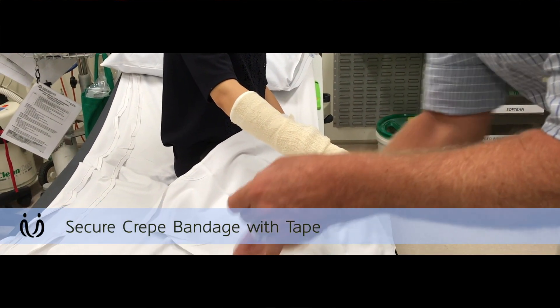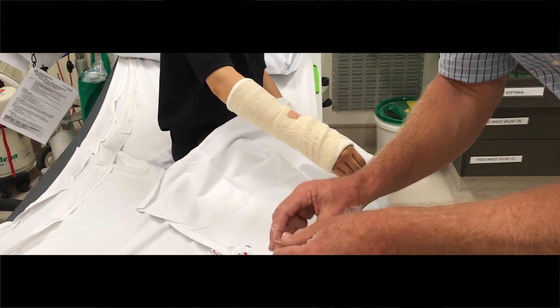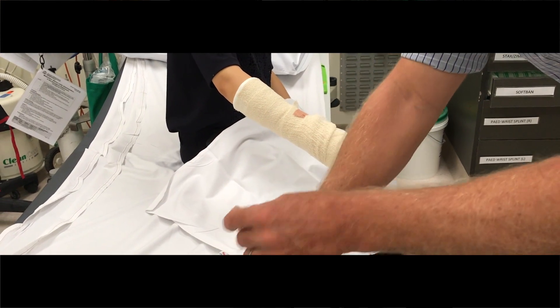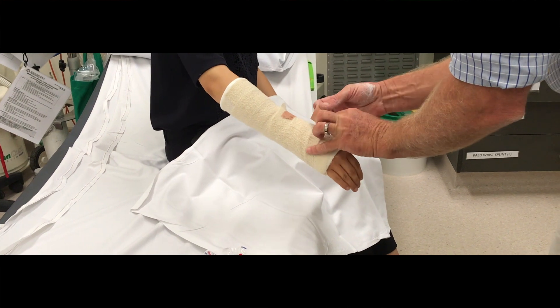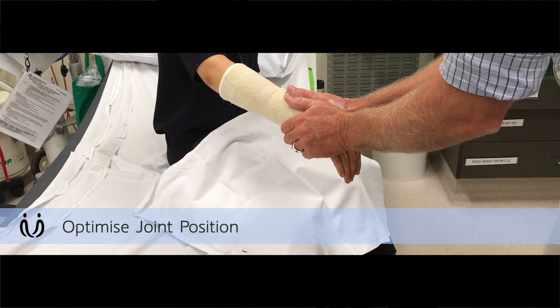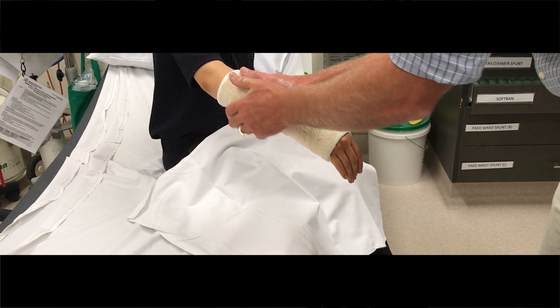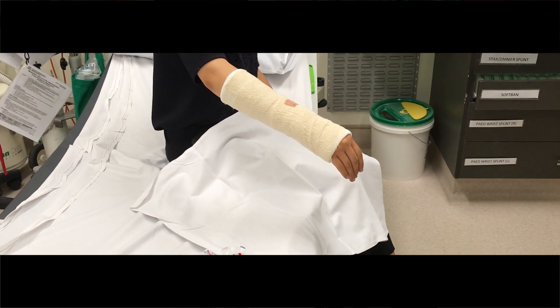Once you've got it on, you want to get their wrist in the position that you want — you want it to harden in that position. As I said, you want it slightly ulnar deviated, slightly flexed, something like that but very minimally. Then just give it a gentle squeeze so it's set there. And then you tell the patient that it takes hours for that to fully harden.